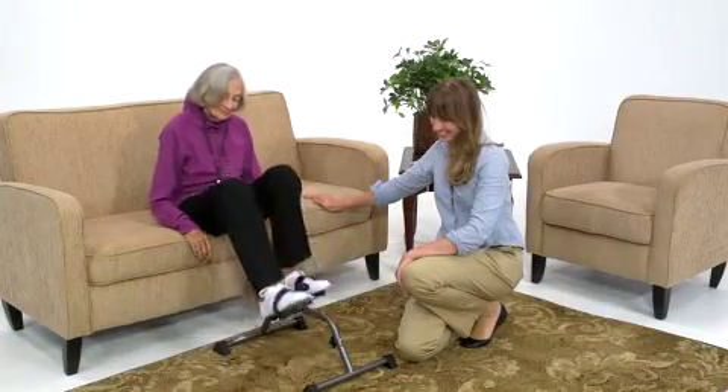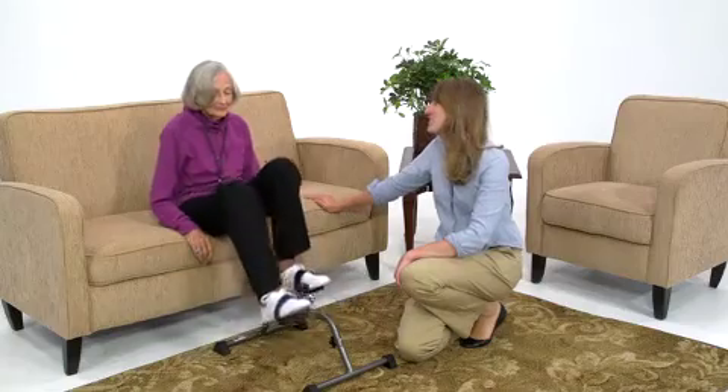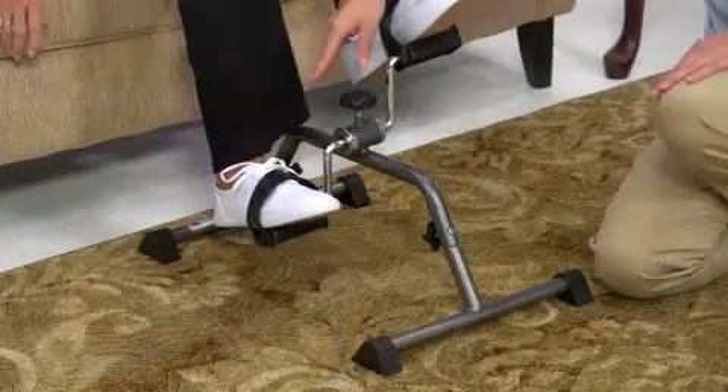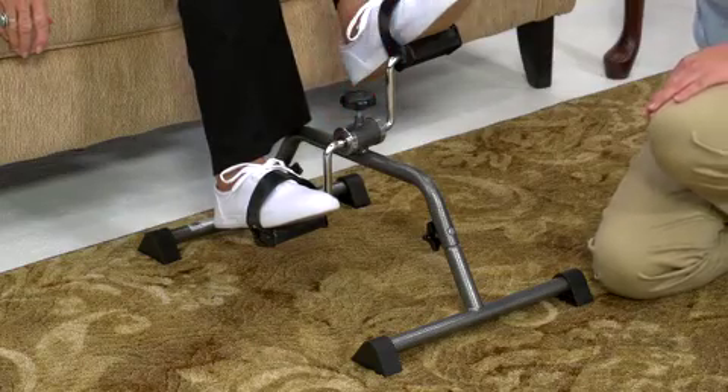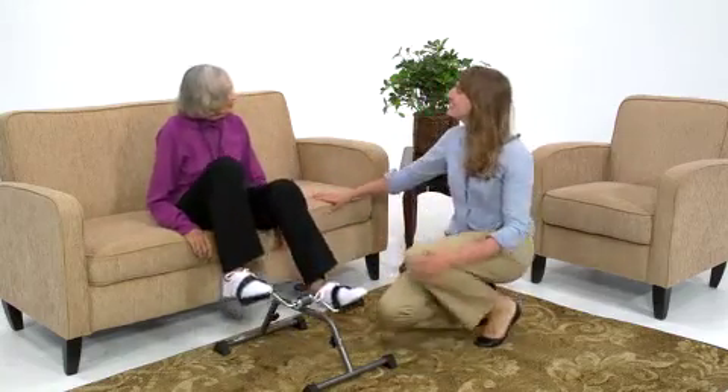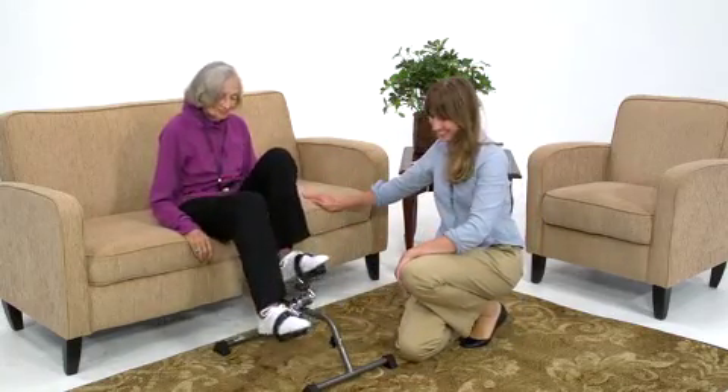Sitting on a chair, couch, or bed, users simply pedal at a safe, comfortable speed with arms or legs. This resistance knob allows users to adjust the tension to fit their level of ability. It's great for stimulating circulation and toning arm and leg muscles while watching TV or even reading a book.